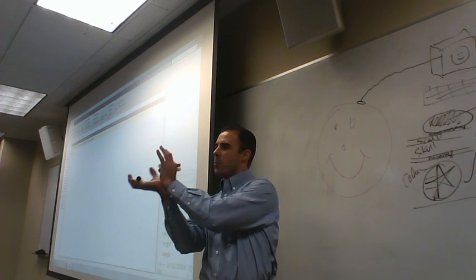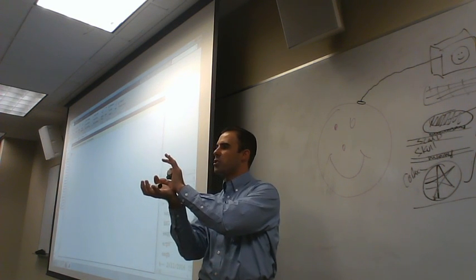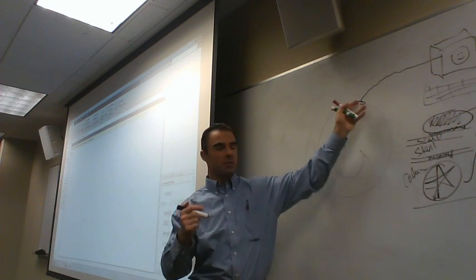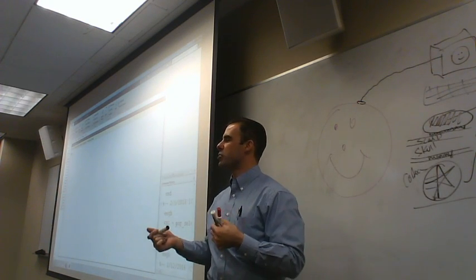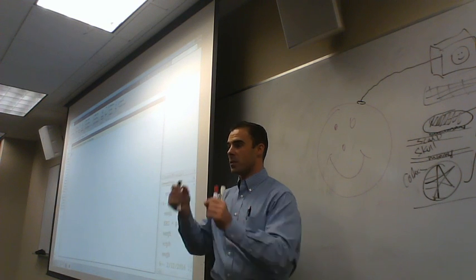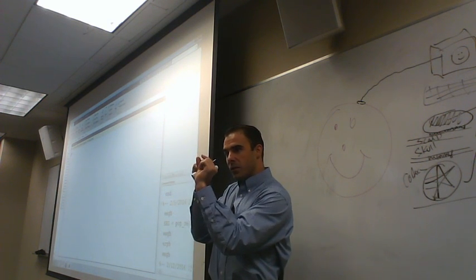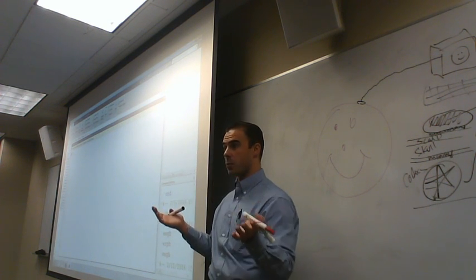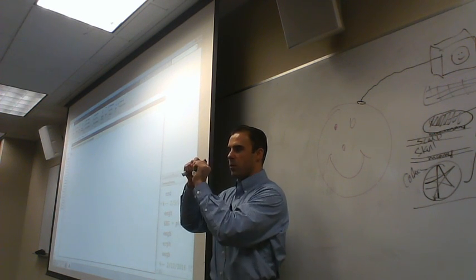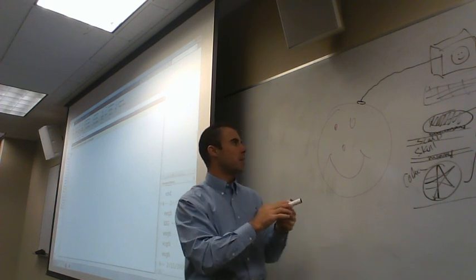So when we put these electrodes on people's heads, those electrodes are going to have a little cup around them to hold the gel in place, and they're going to rest on, say, someone's head. We need a way to get that gel in there, and the way that we'll do that is we're going to use a syringe with a tiny little needle on the end of it. It's a blunt needle, it's not a sharp one. And we just use it to inject through a hole that basically creates that channel down into.